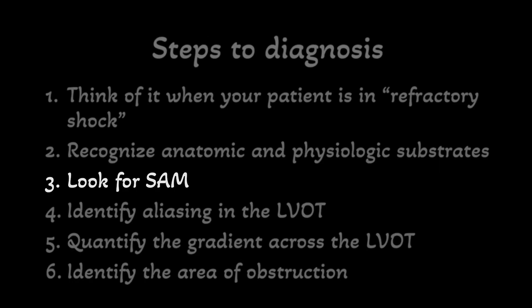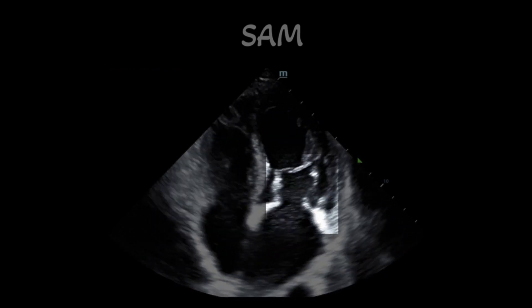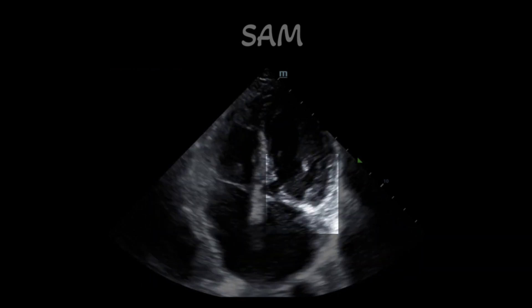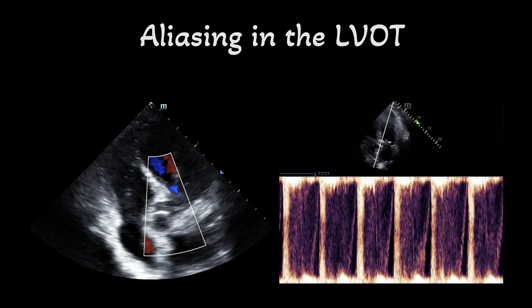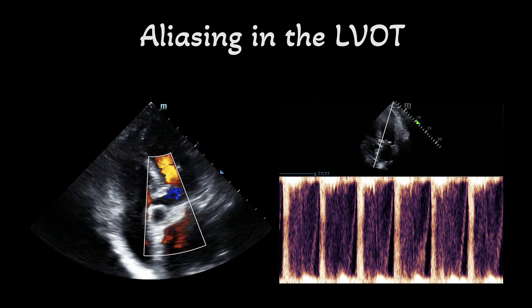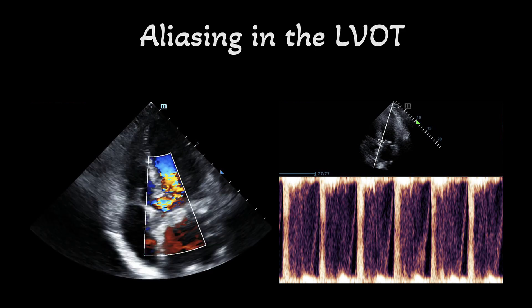Next, look for evidence of systolic anterior motion of the mitral valve leaflets. Pay close attention to the mitral valve leaflets in this clip — notice that during systole, the mitral valve leaflets swing toward the LVOT. Next, identify aliasing in the LVOT. Aliasing on pulse wave Doppler or color Doppler occurs when the speed at which blood is traveling exceeds 1.8 to 2 meters per second, confusing the Doppler signals so the ultrasound machine does not know which direction or how fast blood is moving. On color Doppler, aliasing appears as light blue and yellow flow through the LVOT. On pulse wave Doppler, aliasing in the LVOT demonstrates lines without a clear VTI waveform.